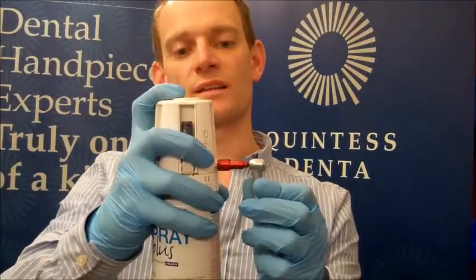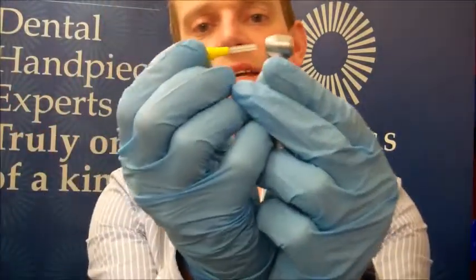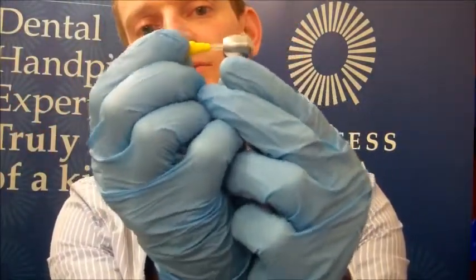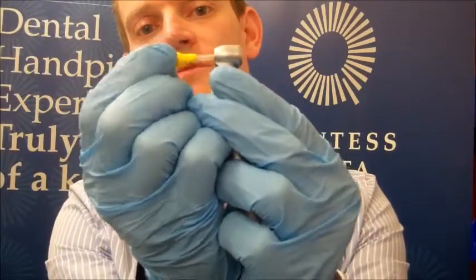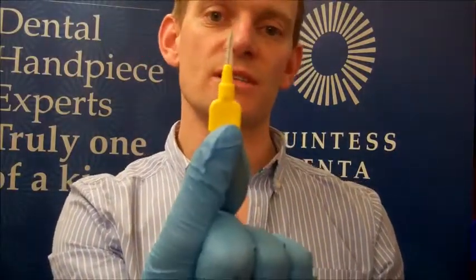So to prevent that happening, again, shake your can of oil, level surface, and this only needs 1 little spray of oil. Now, once you've that done, take a TP brush and pass it back and forth through the chuck where the burr enters. Again, that should be coming out perfectly clean. If there's any dirt on that, spray it off with a bit of oil or clean it off with your tissue paper and redo it. Again, that should only be done once per week.